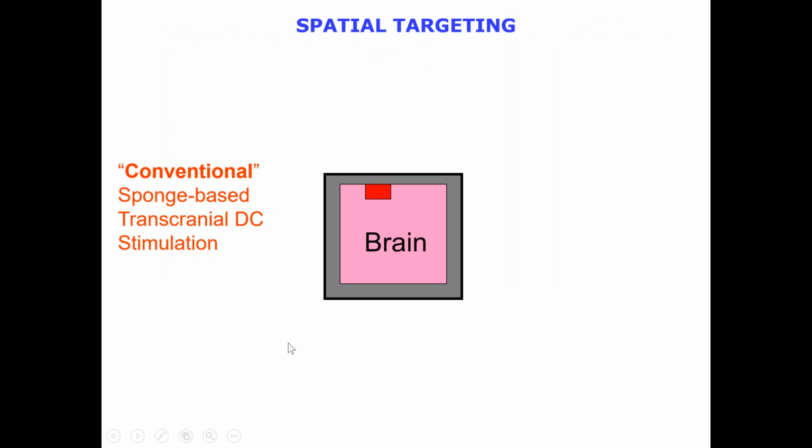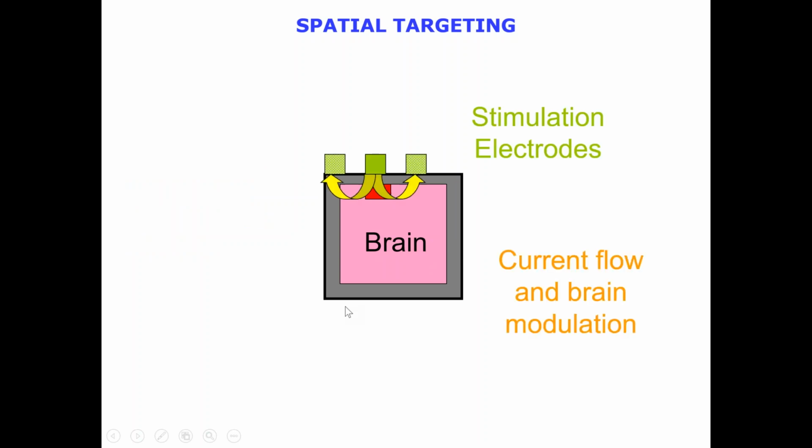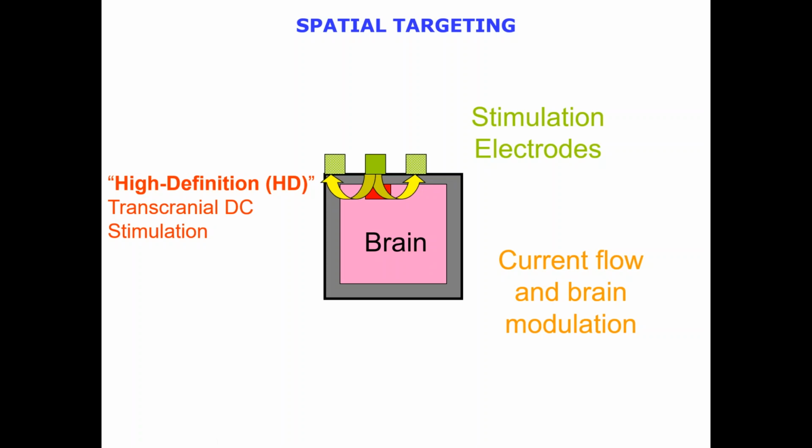And in the conventional one, the electrodes are pretty large, and you had a lot of changes in the brain because the electrical field was quite large. So what we've moved to now is really being more directive with what's called high definition. So if you want to hit just one hub, there's ways to do that. We don't have to get into the details of that, but there's ways to take the patient's own structural brain imaging, find that particular area in their brain that you want to activate, upregulate, or downregulate, and do that just in that area, or another particular area.